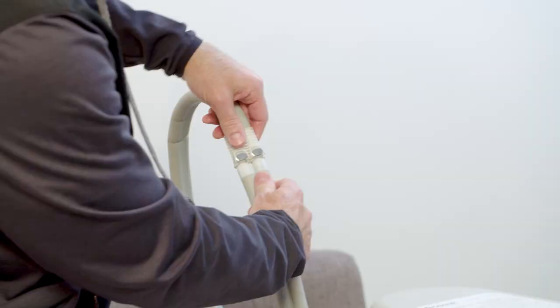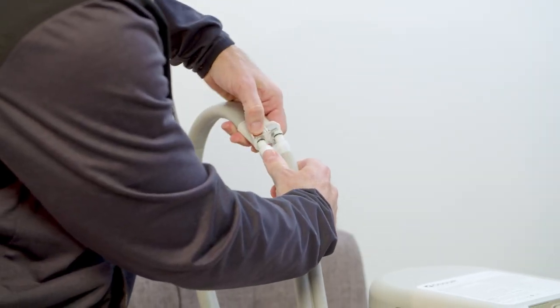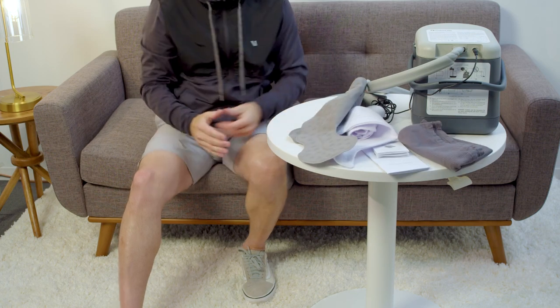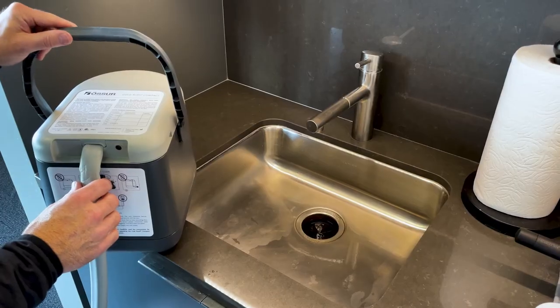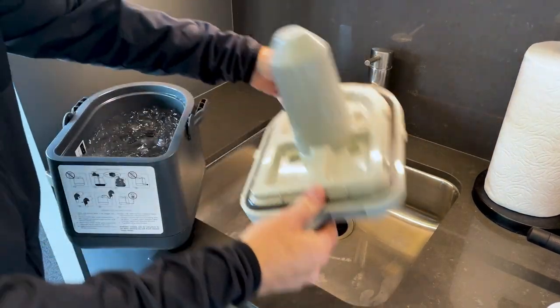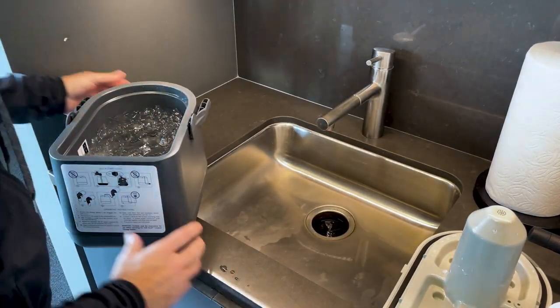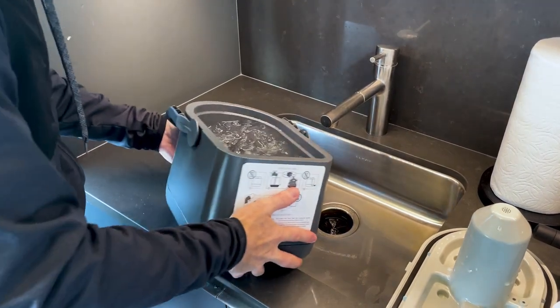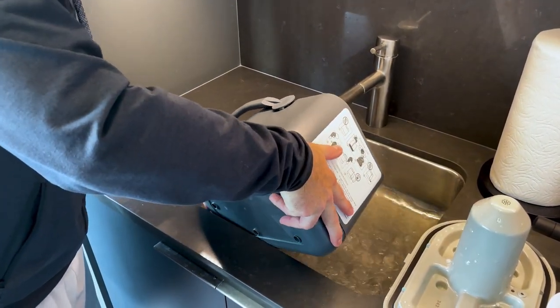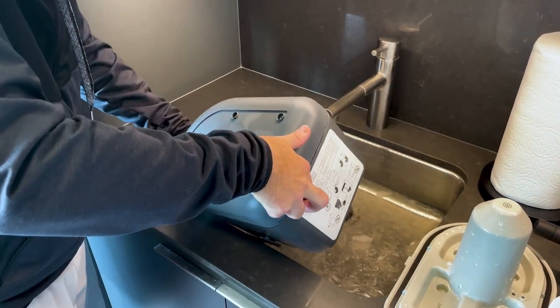To disconnect the hoses, press the release tabs on the coupling and pull the connectors apart. To open the lid, press the handle down to disengage the lid seal, then lift to remove. Drain all of the water out of the cold therapy device after each use. Follow instructions before each use.